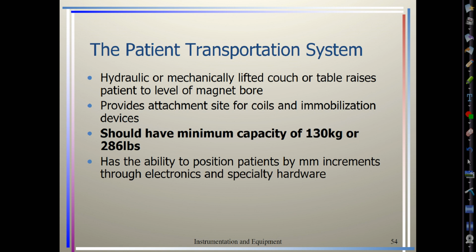Okay? And all those coils, remember, you want to make sure they go down the middle of the patient in a very straight fashion. If you have some kind of barrier between those cables and the patient, the better. But remember, we never want to loop those coils when we're plugging them in and create that circuit.